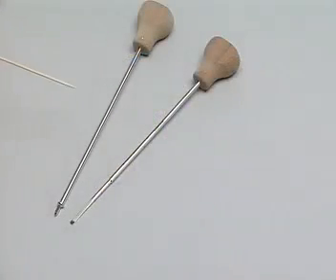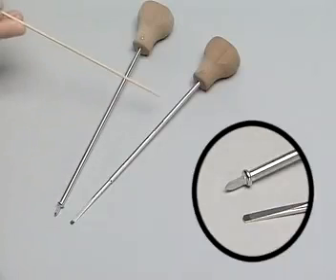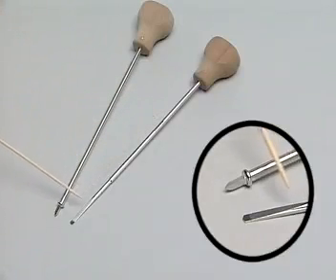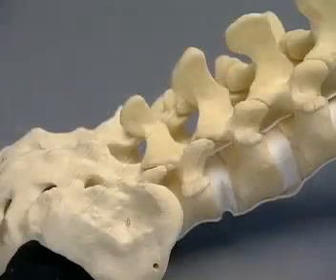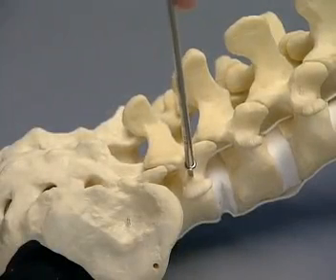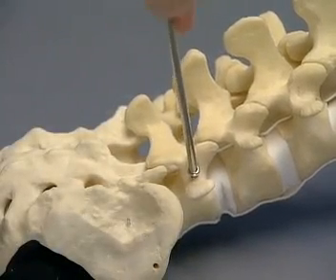The instruments used in opening the pedicle are the USS Pedicle Awl and the USS Pedicle Probe. First, the pedicle screws are inserted in the usual manner. The hole is started with the Pedicle Awl and completed with the Pedicle Probe.